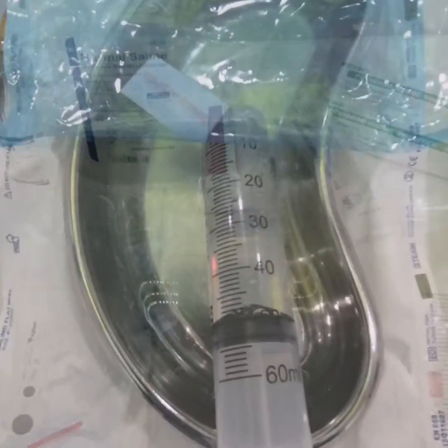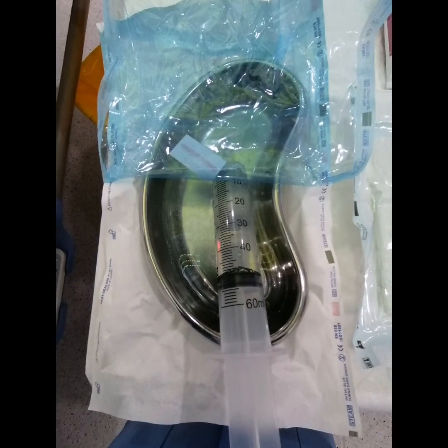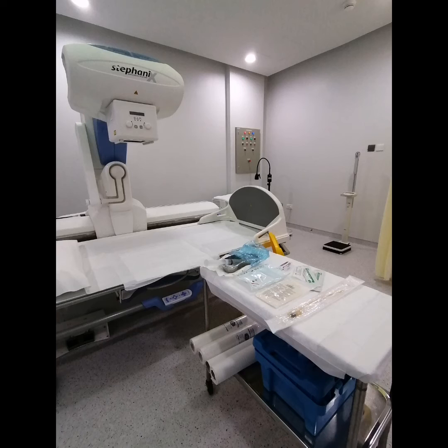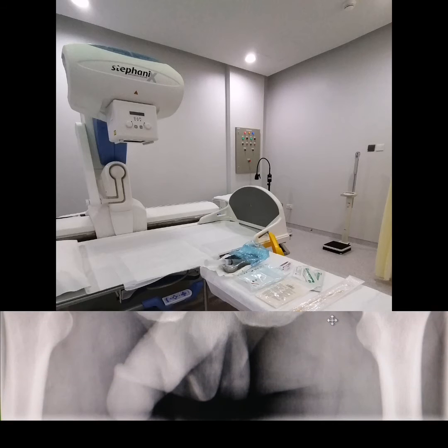Dilute 50 ml of contrast media with 50 ml of normal saline in a kidney dish. Fill the 50 ml catheter tip syringe with the diluted contrast to be ready. Do your scout views and call the attending radiologist to proceed with the procedure.